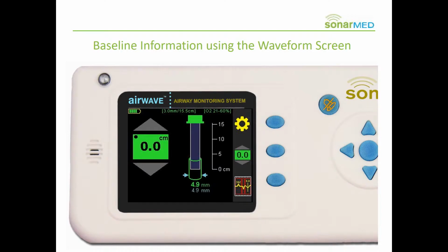So here we are again, back to the main monitoring screen. And we have our baseline information in there now. So I'm reading any movement that may have occurred, and right now I don't have any movement in the endotracheal tube at all. I also don't have any obstructions in the endotracheal tube, and I know that I have a trachea that's 4.9 millimeters in size.